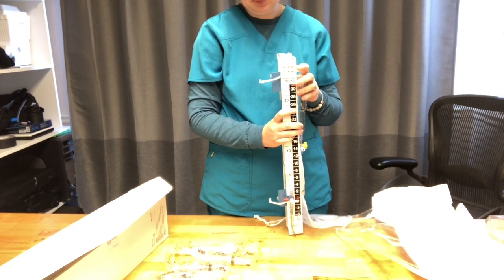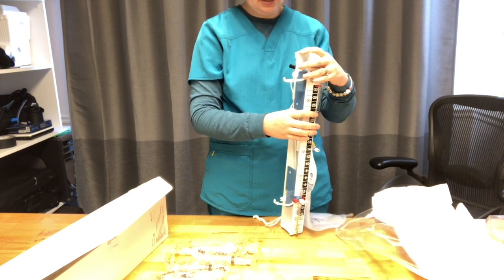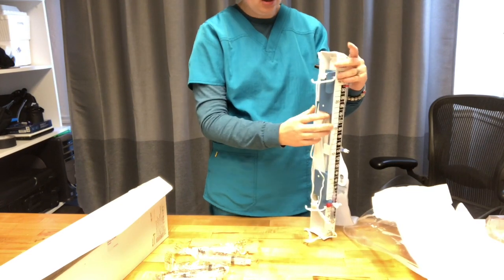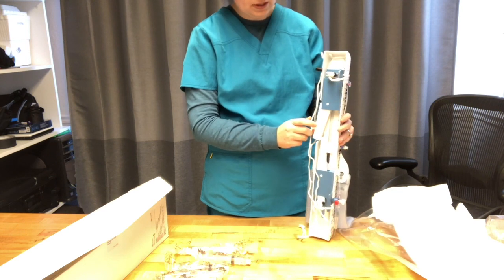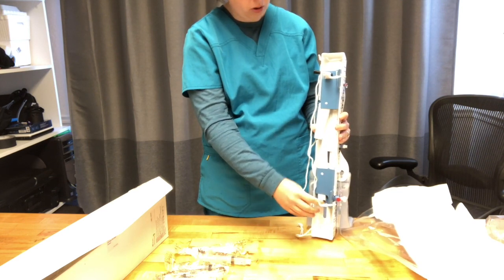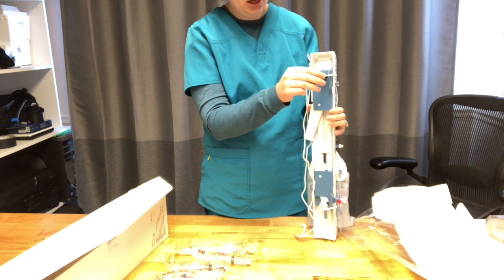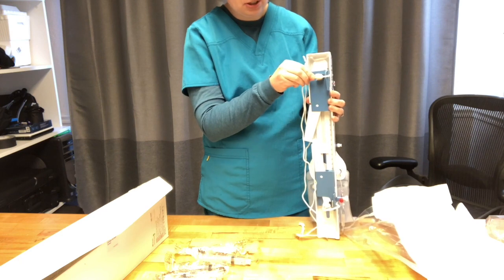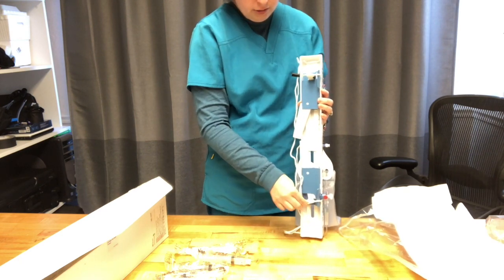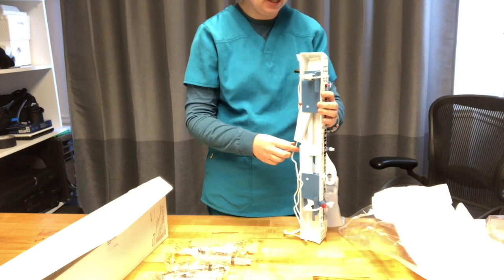After gathering your equipment and performing hand hygiene, you will secure the panel mount to the pole. To secure it to the pole, you would hang it using this string. Then on the main body of the pole, you would squeeze this lever and these two clamps would adhere to the pole. Then for the final securement, you would pull the straps over to fit within the levers. Nothing else should be on the pole. The pole should be a free pole by the patient's bedside.